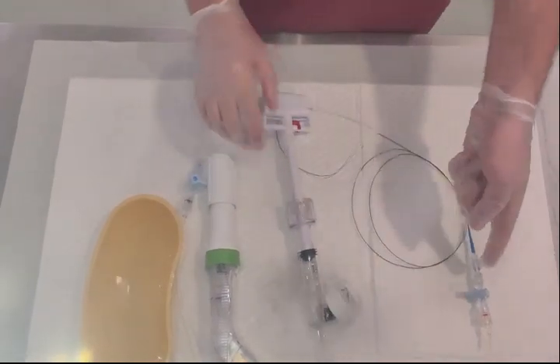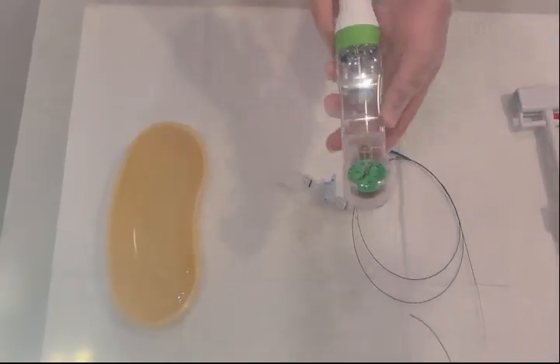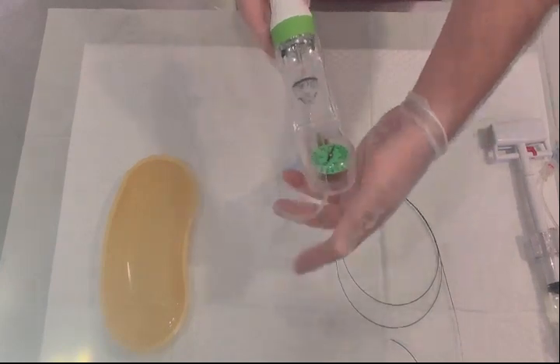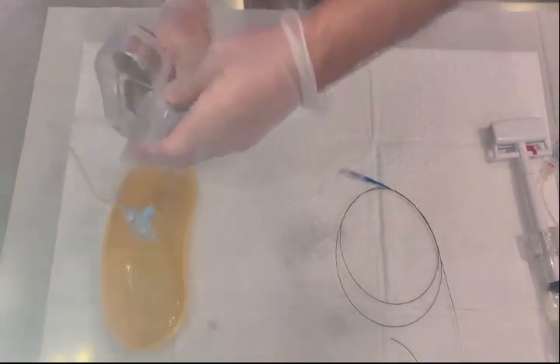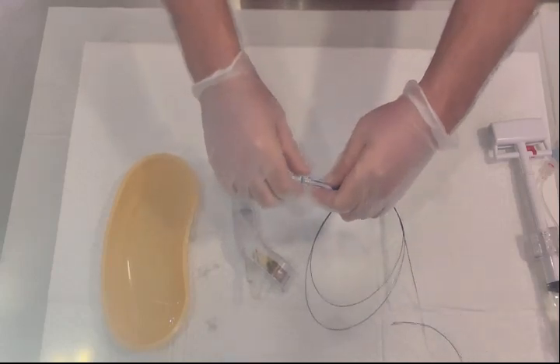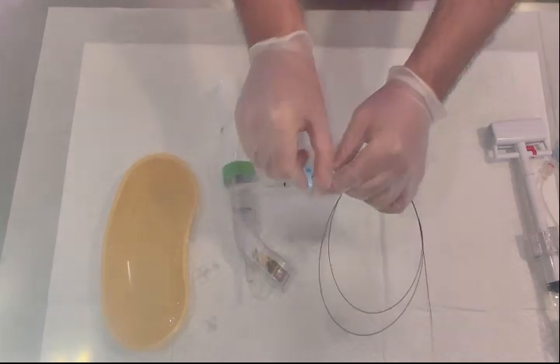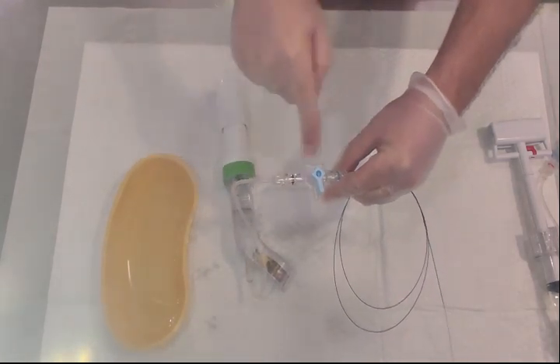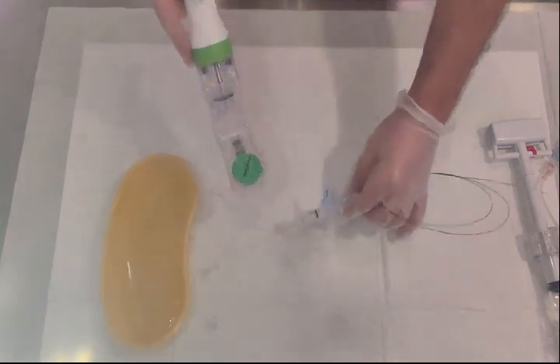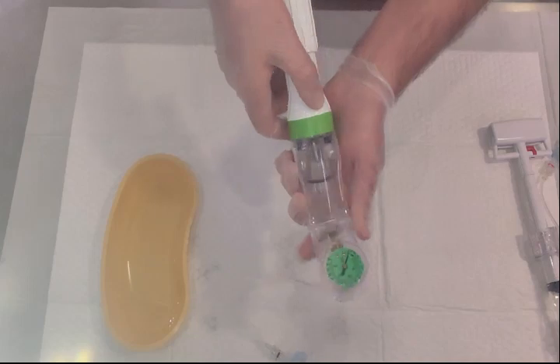Now I will show you how to use the second inflation device. The procedure is the same: attach it to the balloon side. The three-way stopcock should be closed initially, then opened towards both the inflation device and the balloon. To operate this device, you first need to lock it.